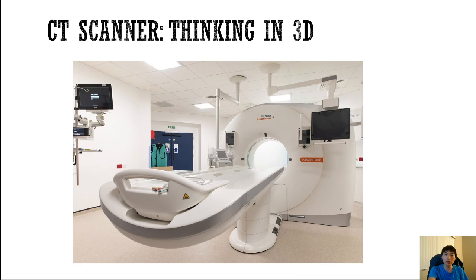Extending the idea of projection imaging, which shows basically just one angle through the object. For example, if you're looking at the hand and your X-ray generator is at the top, then you're basically just looking at one angle directly straight down the hand. But what if we can acquire a series of projections at different angles? For example, if you rotate the detector, and also you would have to rotate your X-ray source and your detector together. So what if we do that? Then maybe we can get some more information and get a bit more spatial localization in three dimensions.